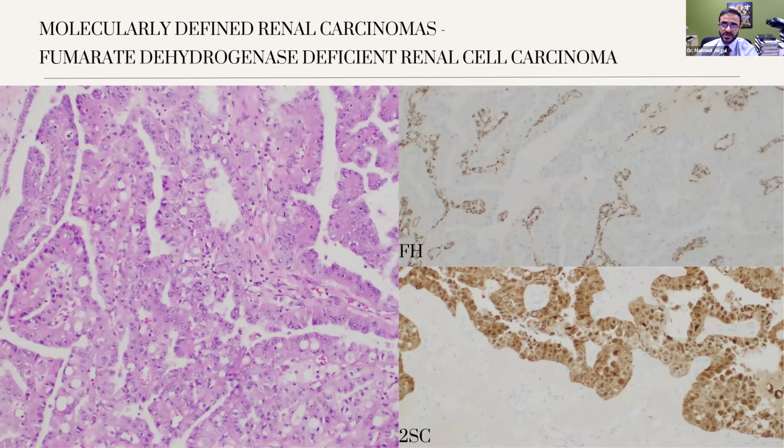I told you GATA3 can be very tricky, and we published a case report when I was a faculty at Albany Medical Center with Dr. Pacheco, who is now a gastrointestinal pathology fellow at Stanford University with Dr. Sangoi. And this case was actually diffusely positive with GATA3. The intensity was variable, but it was there. And it was also diffusely positive for CA9, and it's a known thing.